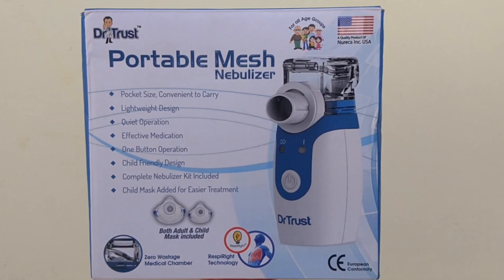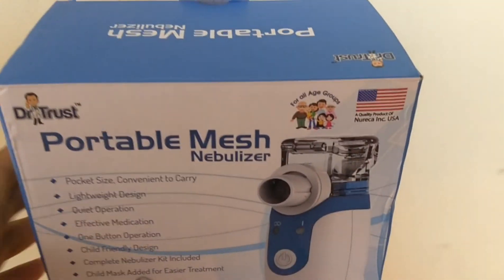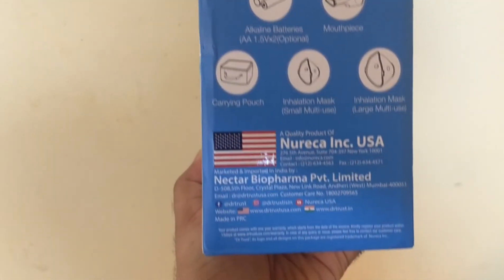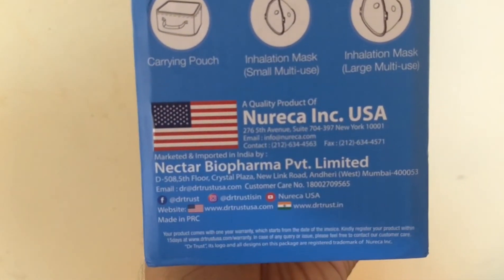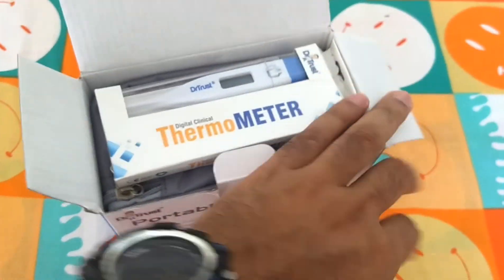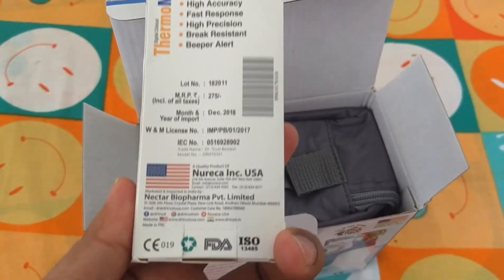Hi friends, today we are going to unbox the Dr. Trust portable mesh nebulizer. I bought it from Amazon for a price of 1900, but the price is labeled as 9000. It's very neatly packed. I also got a digital thermometer along with this pack as free, from the same brand Dr. Trust.